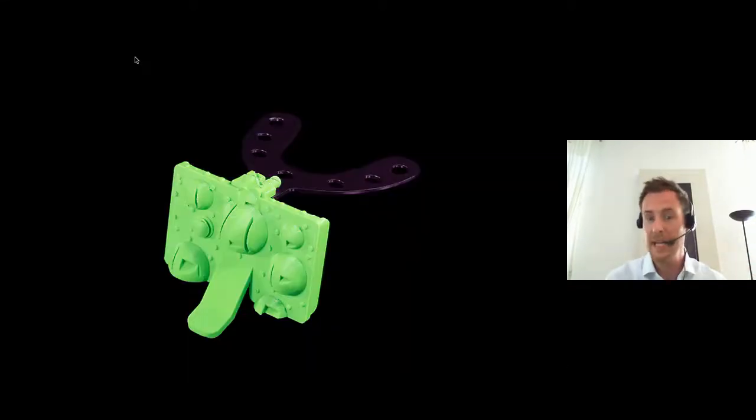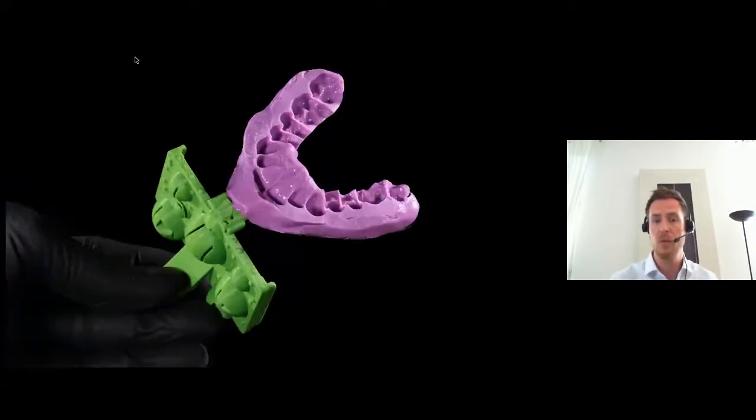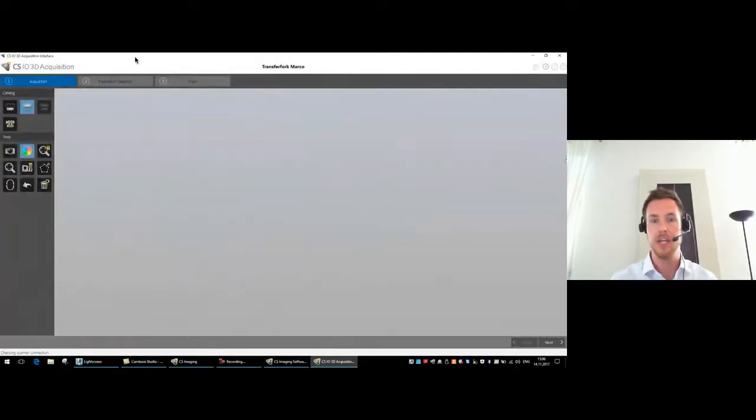That means the doctor is able to scan the whole fork with their intraoral scanner. And this is fantastic. So the doctor can provide all the data I need as a technician to continue to work digitally. So the workflow is similar. We just squeeze silicone again onto it. We make a 3D facial scan with the fork and the cover. We take the fork out of the mouth, and now it's time to scan it with the intraoral scanner.